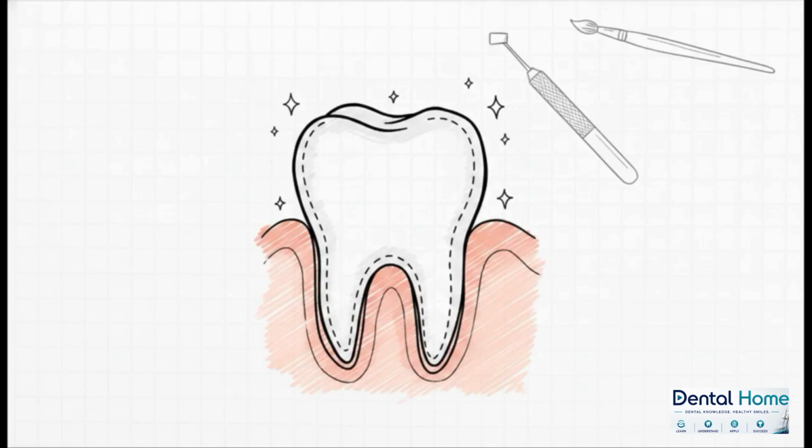Because the crown can seat fully and precisely exactly where it belongs, the ceramist can create ideal contours. They can completely perfect the emergence profile, which is how the artificial tooth appears to naturally grow right out of the gum tissue, just like a real tooth. If the path is wrong, and the crown ends up bulky or unseated, the illusion is completely broken.